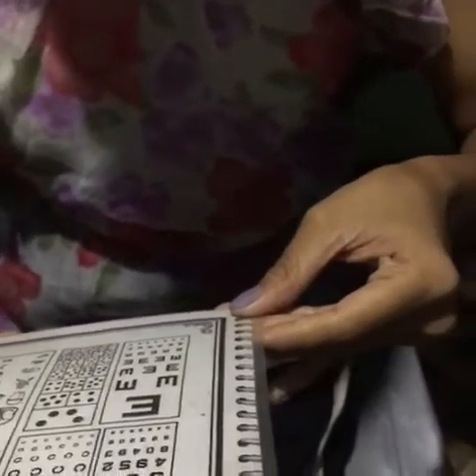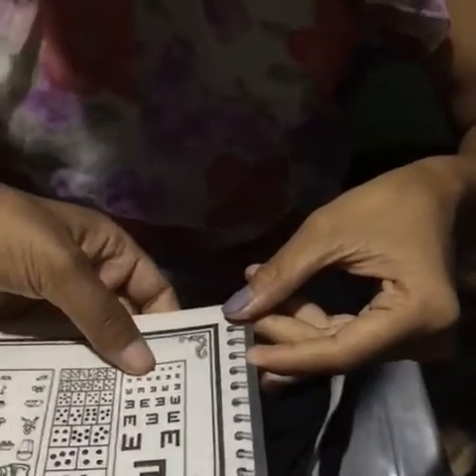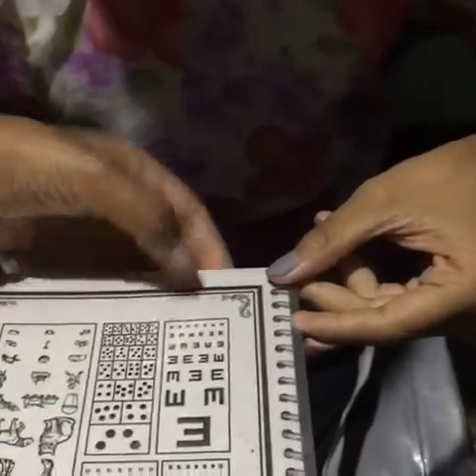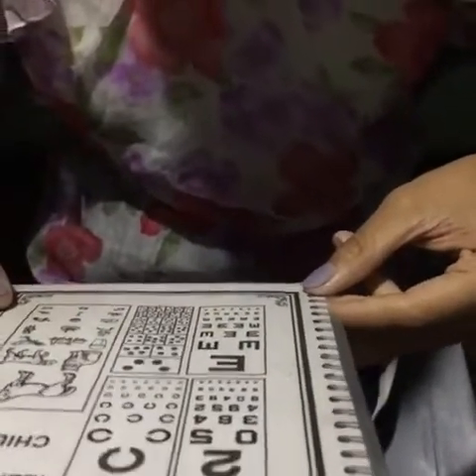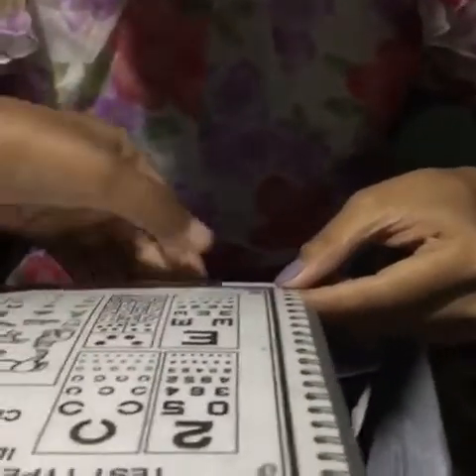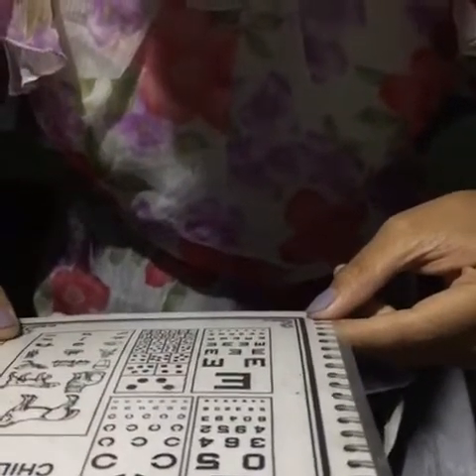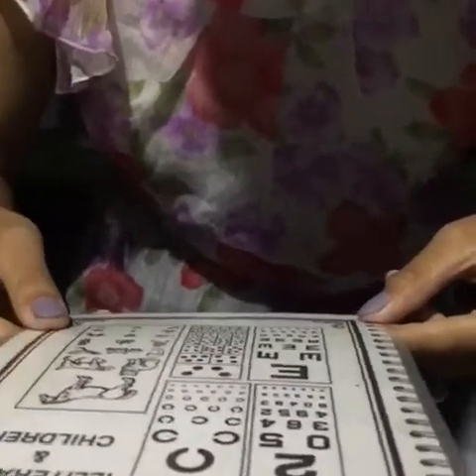She has to constantly focus on the N8 letters, okay. You have to constantly focus on these N8 letters, and I will move this towards your face. You have to report to me when it first becomes sustained blur. When you see blur, you have to report to me that you are seeing blur, okay.